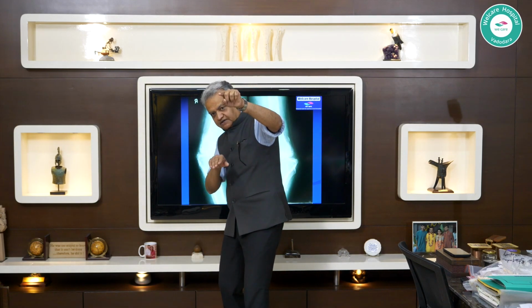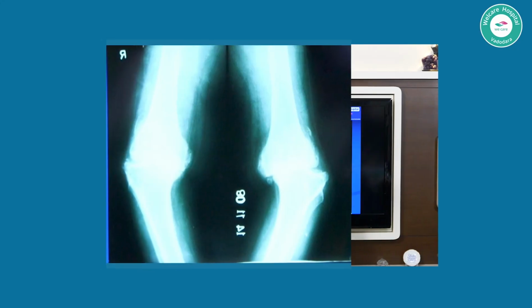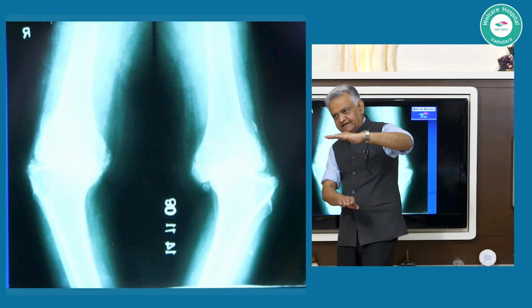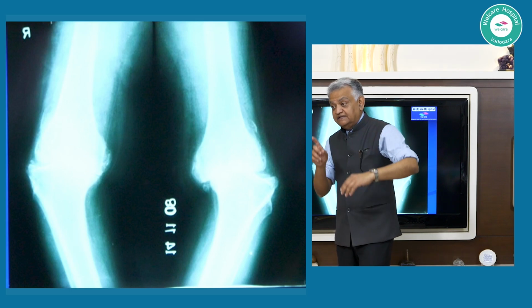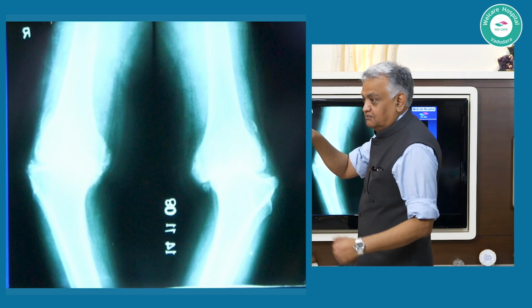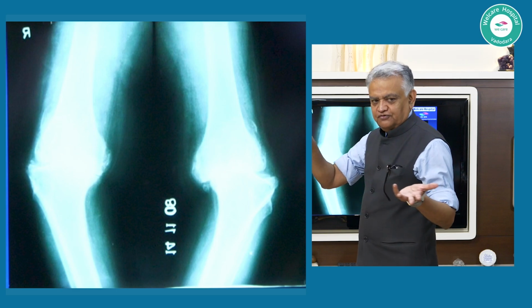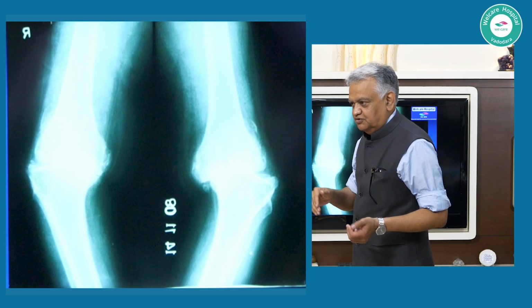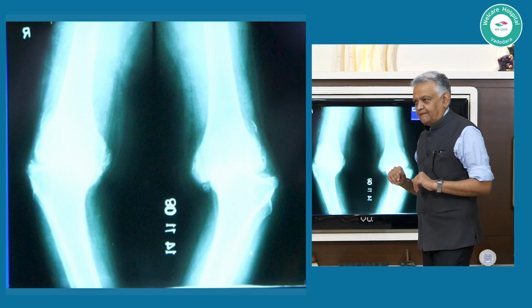You have to step away and look from the far end of the table, and that will very quickly give your mind an understanding that that looks horizontal, and this is in the AP view. In the lateral view, you will by design want some slope, depending upon your philosophy, 3 degree posterior slope, 5 degree posterior slope. Max is 7 degrees, nobody goes beyond 7 degrees, that's too much.